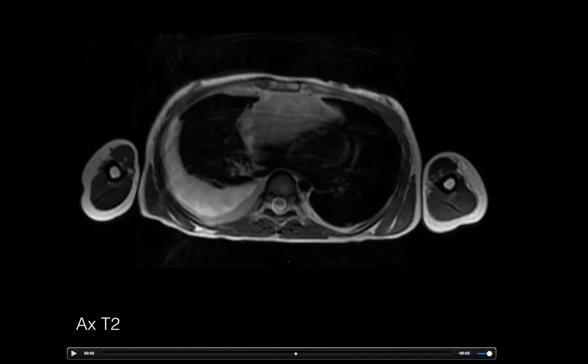So we haven't reached talking too much about artifacts, but usually you get artifacts when you have inconsistent measurements. That often is done in the phase encoding direction because that's a slow dimension. So if you have inconsistency there, you'd see spreading of the signal and aliasing and all sorts of ghosting that looks like that. So you can see them in one dimension.